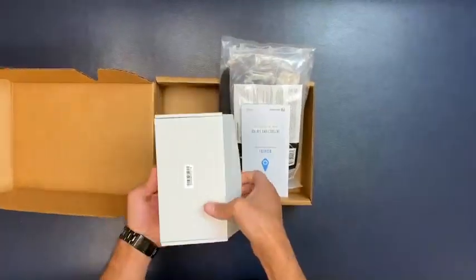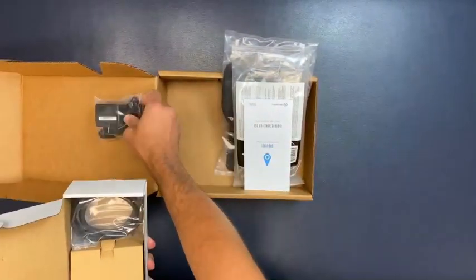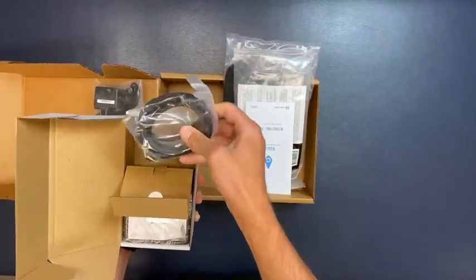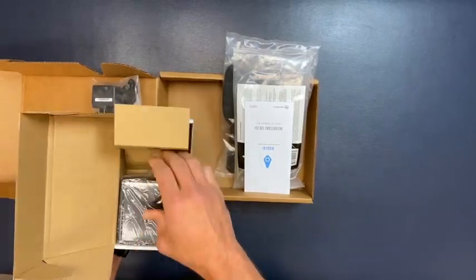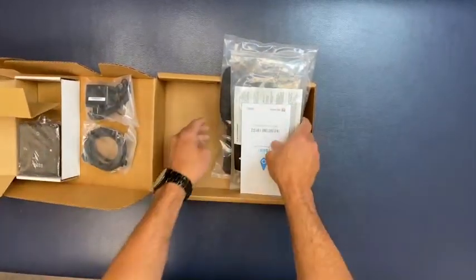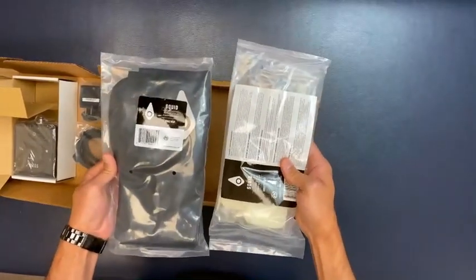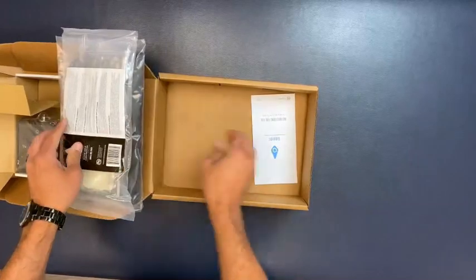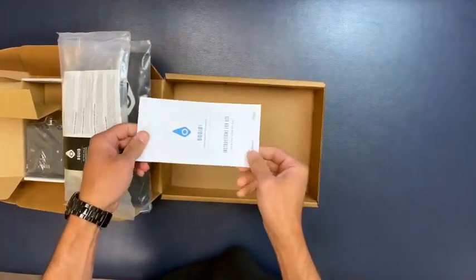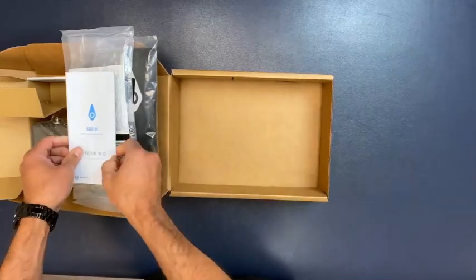In the box, you will receive a Squid Go control unit with a charger and a connector tube. You will also receive an ankle wrap and an ankle gel pack, as well as a user manual and a quick start guide. Please be sure to read the manual and refer to the quick start guide before use.